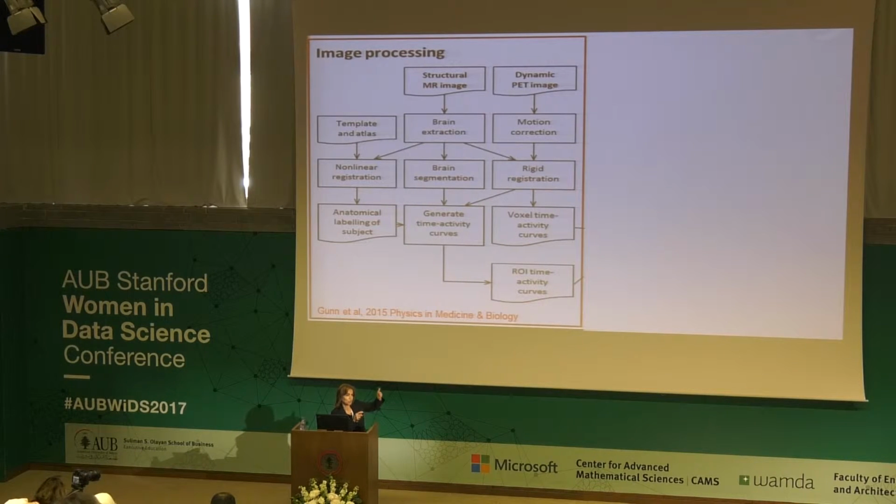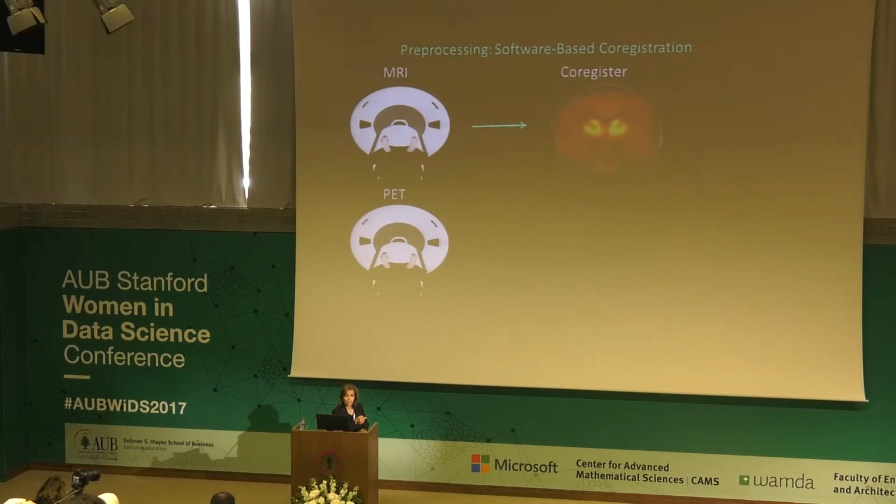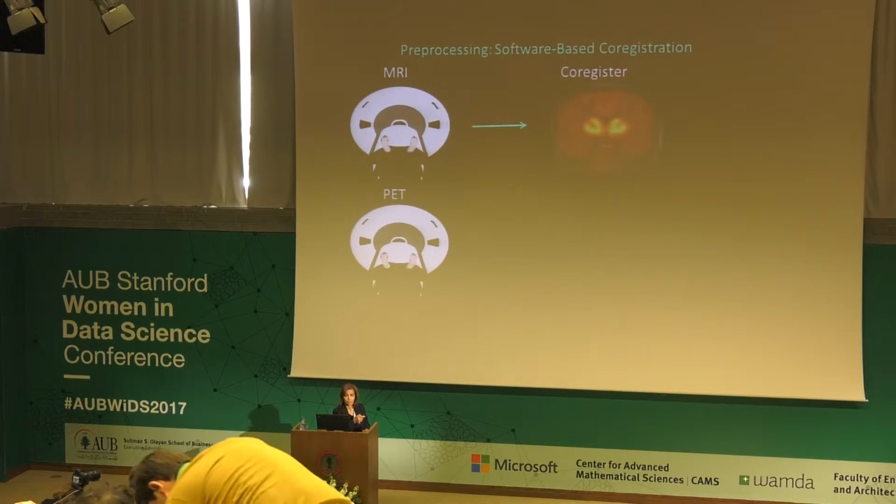Now, you could also use an anatomical template that is derived from an atlas or from different people. So we draw the regions on the MRI and then transpose that onto the PET. A lot of steps are involved in this operation. You have an acquisition over time for the PET images. All these have to be put together so that you correct for movement between them. And then you have to put them together with that MRI so that everything is in the same plane, so that the region drawn on the MRI can be transposed onto the PET.